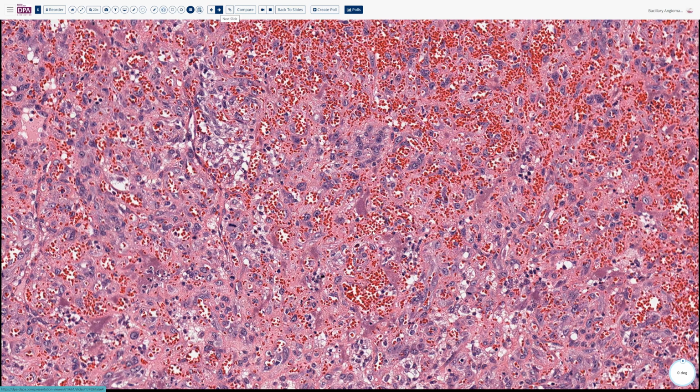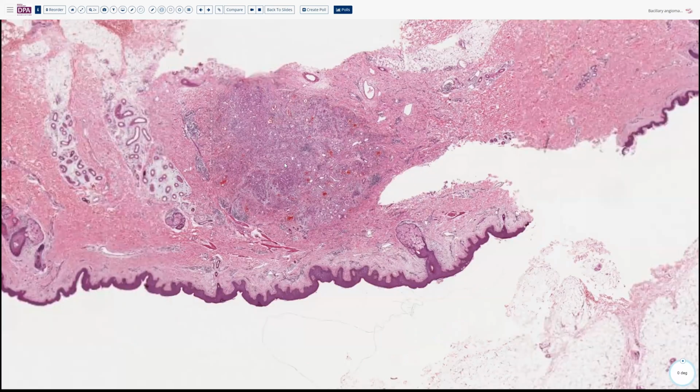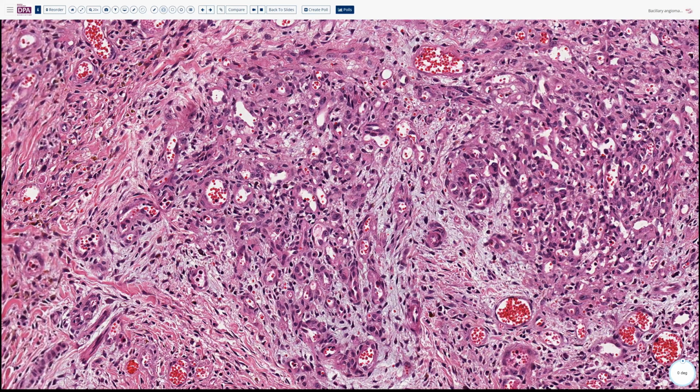This one a little bit more localized and so forth, and with a little less prominent bacterial component here. So you'd have to look around a fair bit to see them, but I think some of these areas like here or a few other areas will have these clustered bacterial forms in the endothelial type spaces.